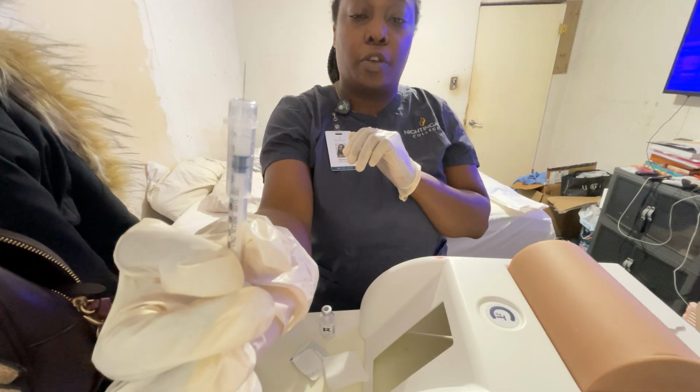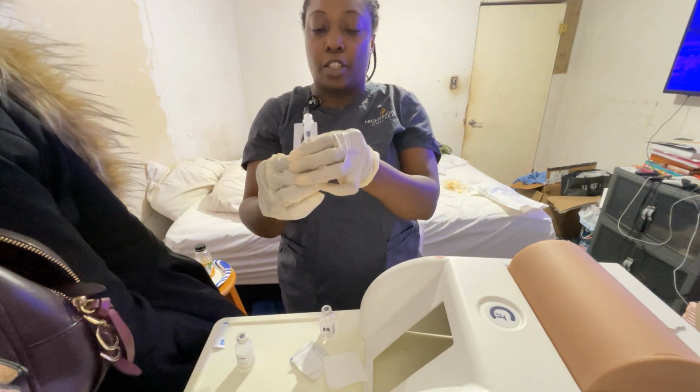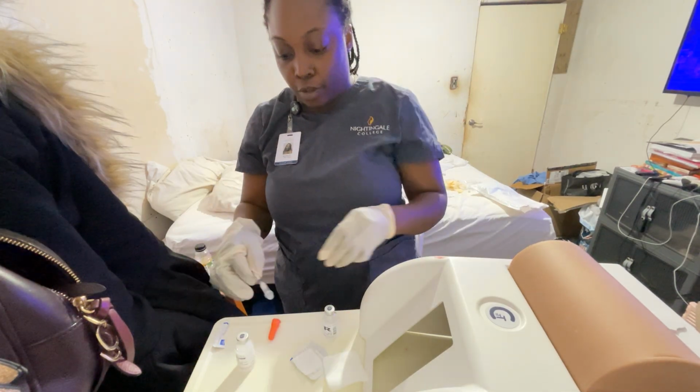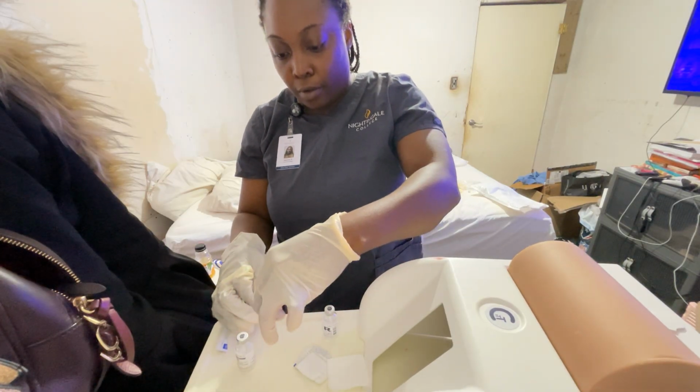So a total of 12 units pulled up. And I'm going to put the top back on here.